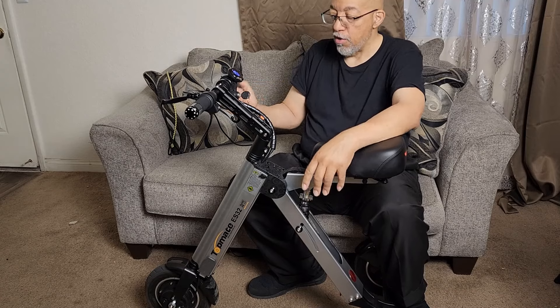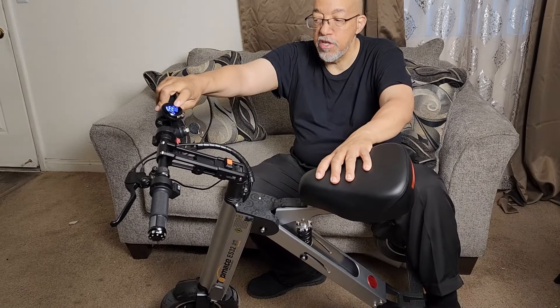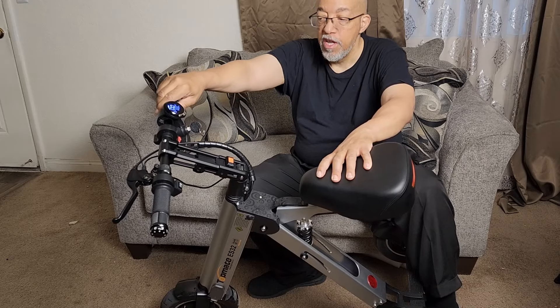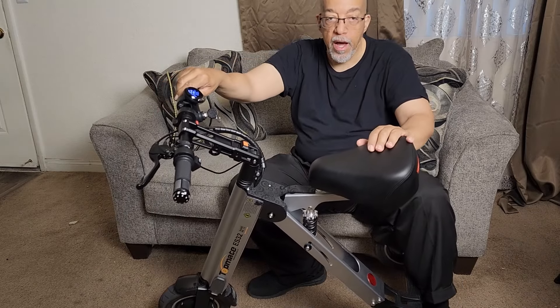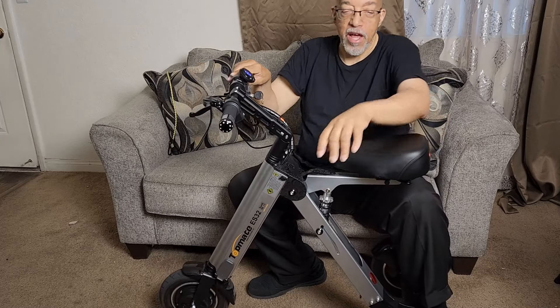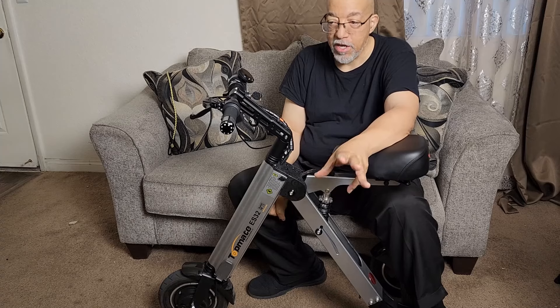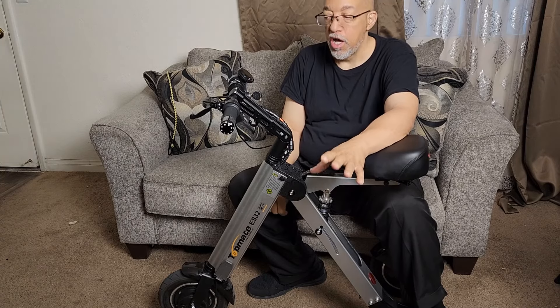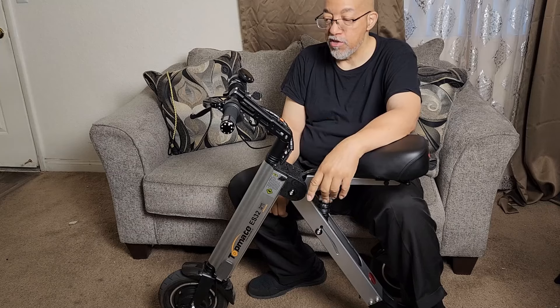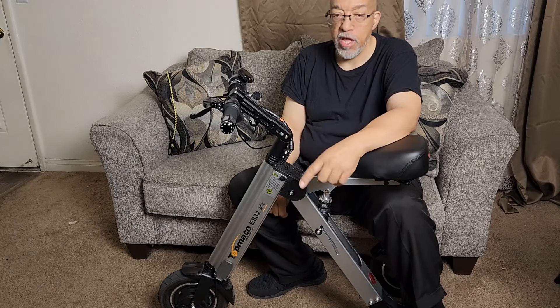Once you turn it on — it tells you the speed, the distance, and how much charge you have left. Now I've been riding this around for quite some time trying to run it all the way down, but it hasn't gone all the way down yet, which is a good thing. I'm glad it doesn't use a lot of battery power fast — it holds on to the charge a long time. I've had this for about two months now and I've only had to charge it once.